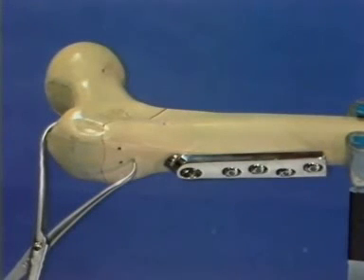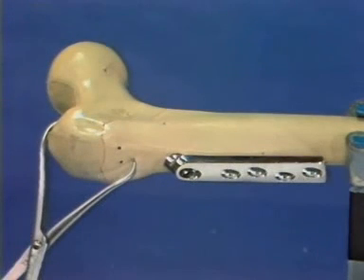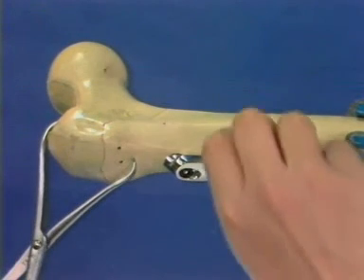At the time of hardware removal, the plate and screws are first removed, followed by the DHS leg screw.